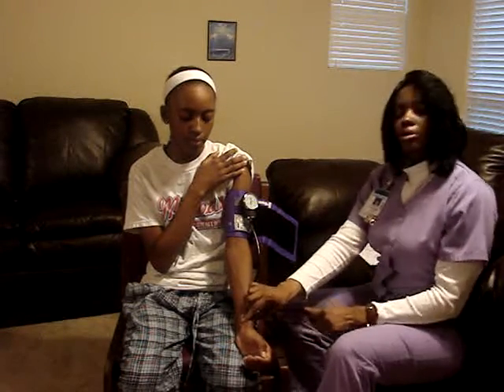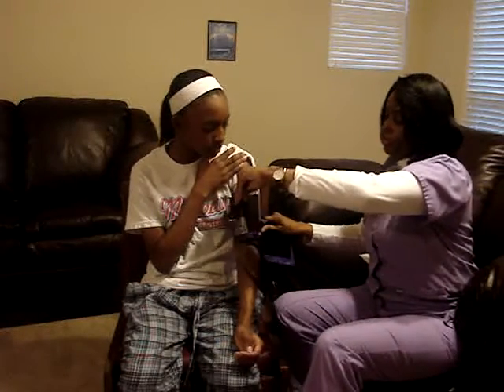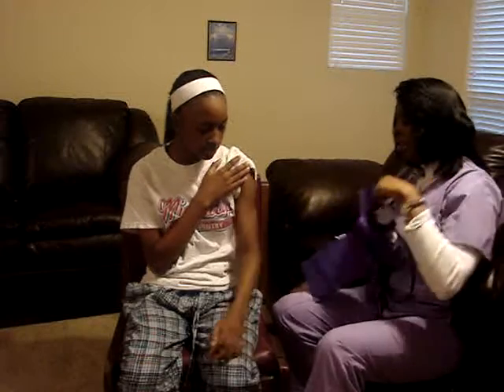Okay. Now I'm going to let her arm hang for about 30 seconds until I'm ready to actually do her blood pressure. So just let your arm hang down, Hillary. Let the blood get back in there. And then we'll do the blood pressure.